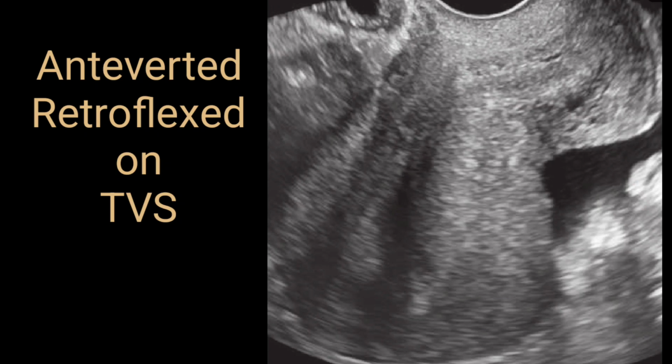So it is anteverted but retroflexed. As far as flexion is concerned, it is slightly flexed, not clearly flexed, in the cervical region. On the transvaginal scan, this uterus position is anteverted and retroflexed. On the image you can see a small amount of free fluid in the cul-de-sac.